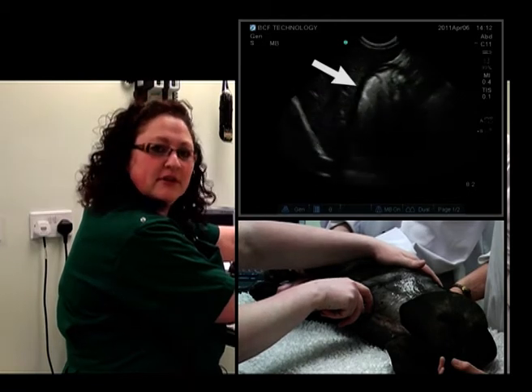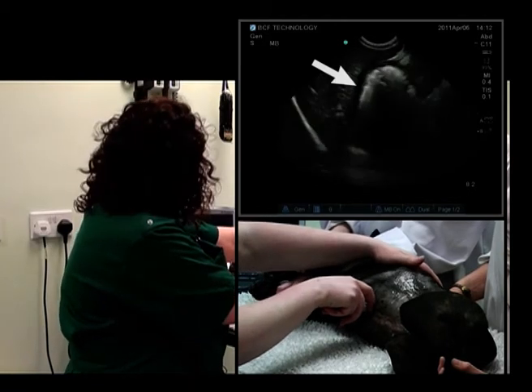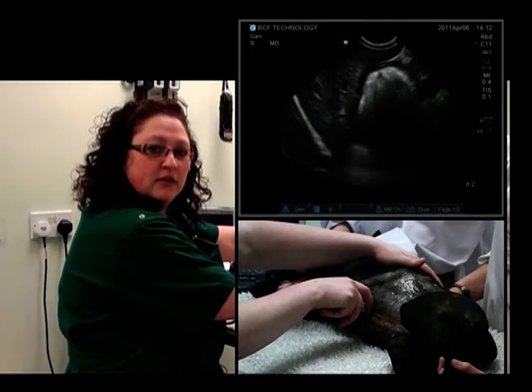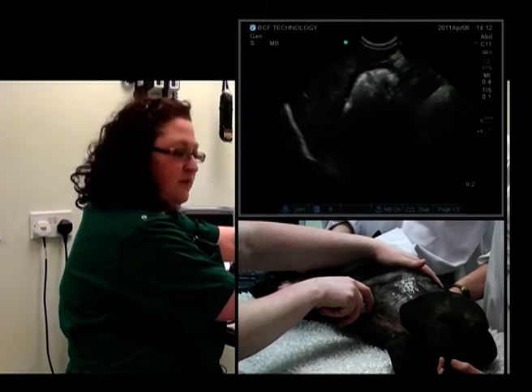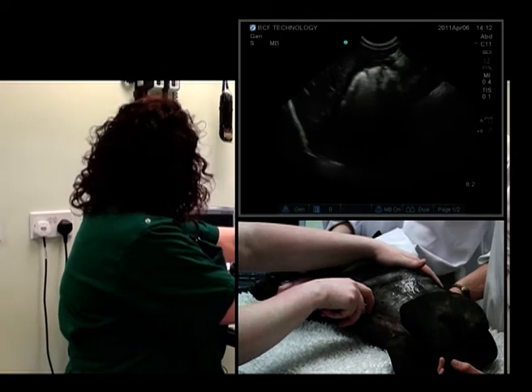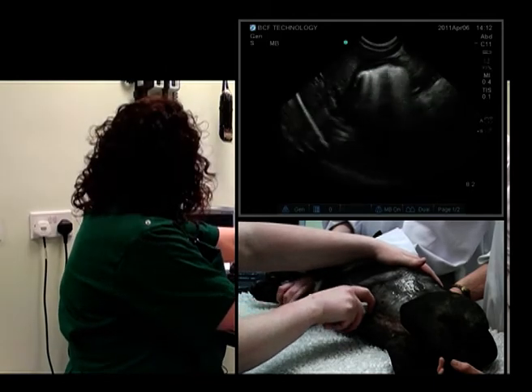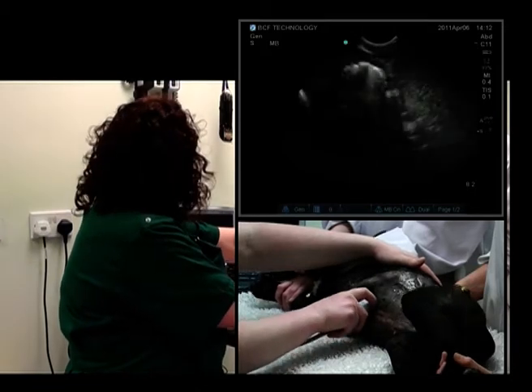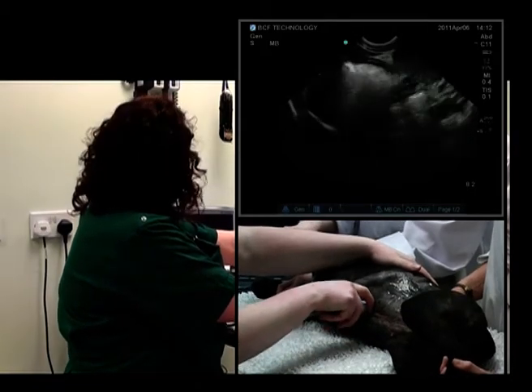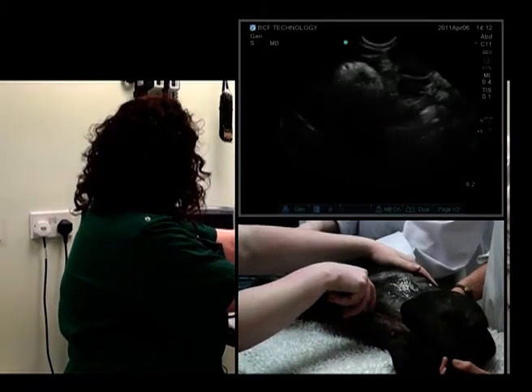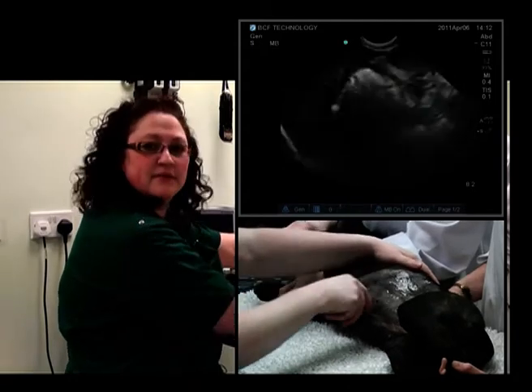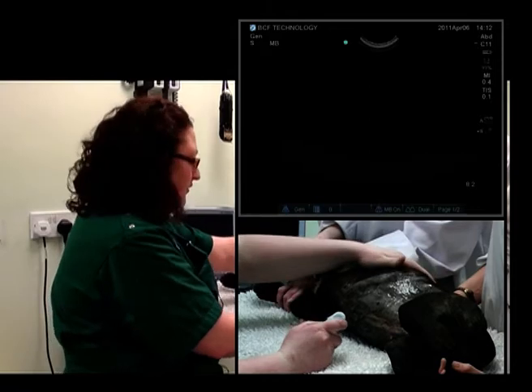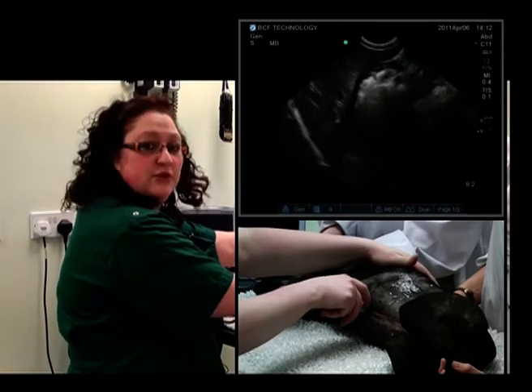And there's the stomach, just at the caudal border of the liver. So we'll evaluate the fundus down to the pylorus in the sagittal plane, and we'll do this with fanning — fanning up through the fundus and down through the pylorus. We'll want to see it in orthogonal view, which will enable us to see it in two planes.